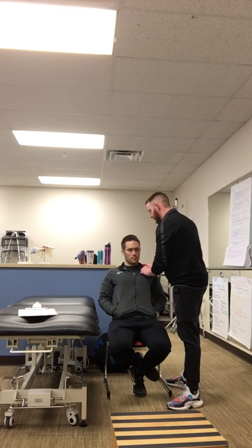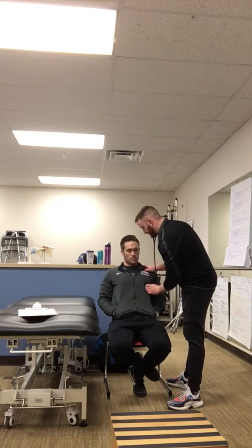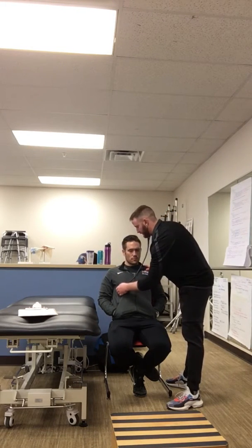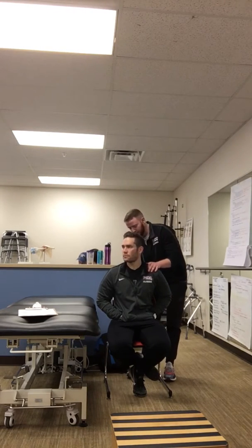Just kind of go to the 8 spots. Same thing, posterior. You're going to have the patient just take some deep breaths for you. Like I said, go a little bit farther down on the last 2.